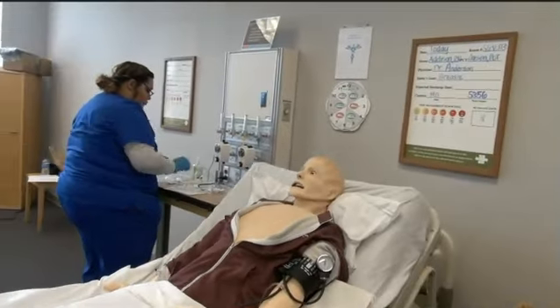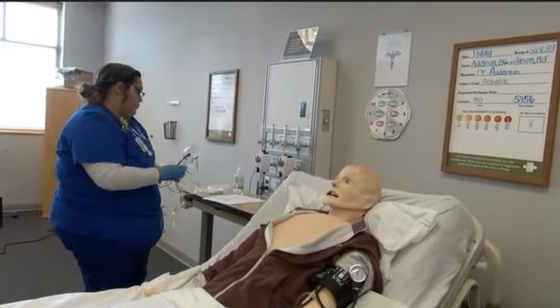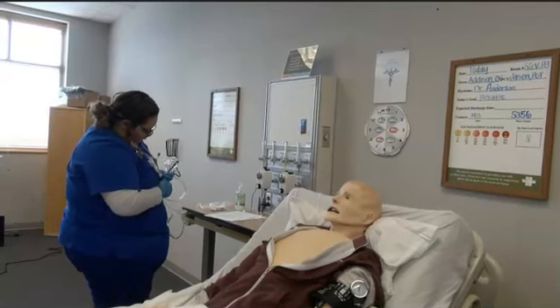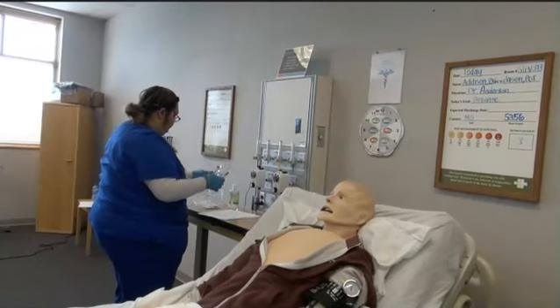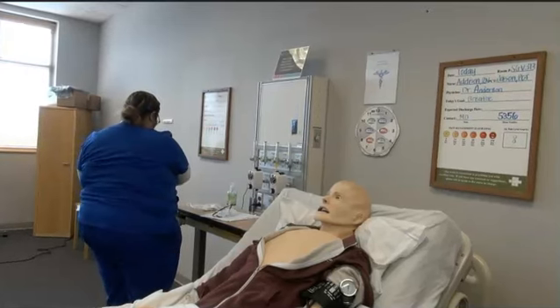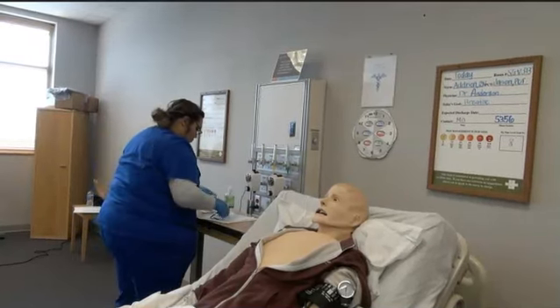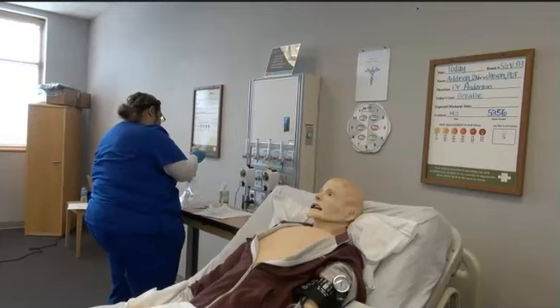Notice she disassembles the handheld nebulizer. All handheld nebulizers should be disassembled and rinsed with sterile water and air dried, or they may be discarded. If you notice, she takes off the masks, winds up the oxygen tubing again, and places it back into the plastic bag. If the mask or mouthpiece is soiled or any part of the nebulizer is soiled, it should be discarded and a new one should be given to the patient.